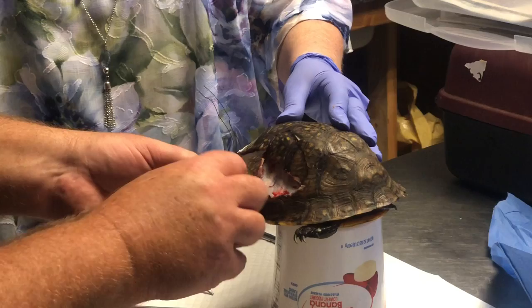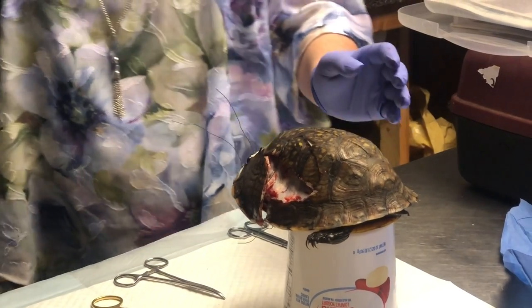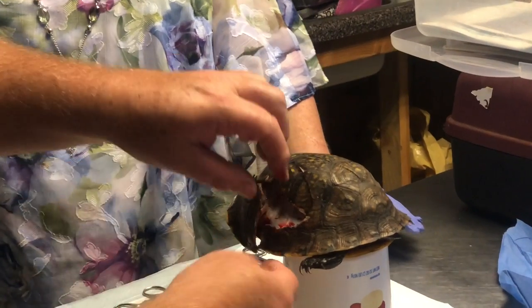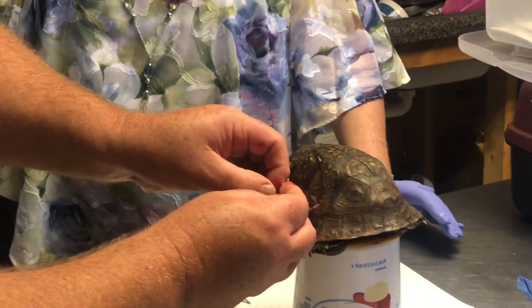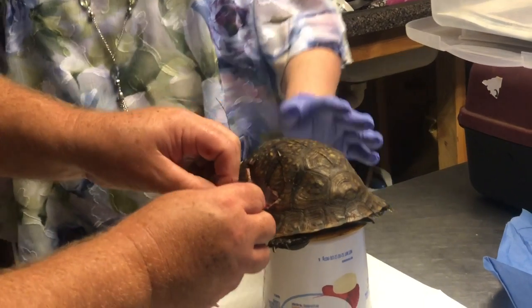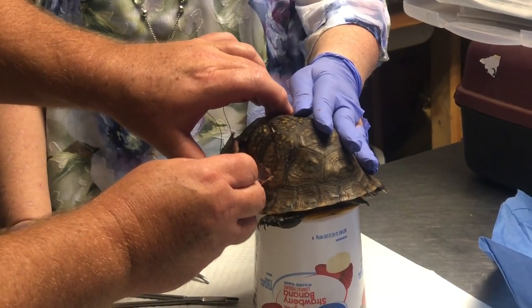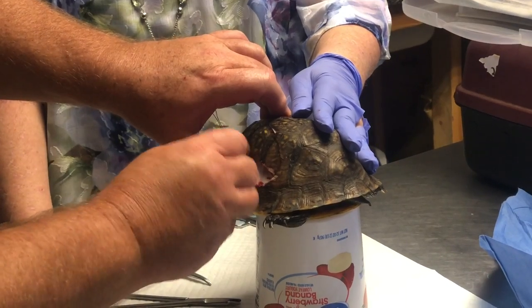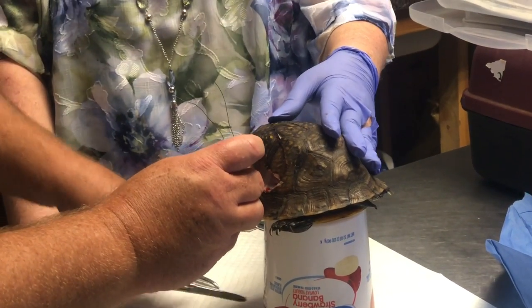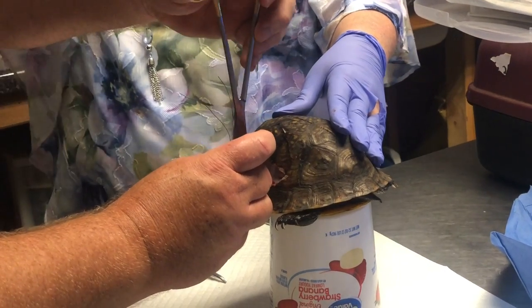Well, not an external splint — wildlife is just weird. External fixation would be amazing though, right? Like a fibula with stainless steel hanging out of his leg — a wildcat running around. But then you've got to catch him and clean it. You've got to catch him and change his splint every week. That's why I would never use a splint in wildlife. With external fixation you don't have to — nine times out of ten they clean themselves. He'd probably look at himself.